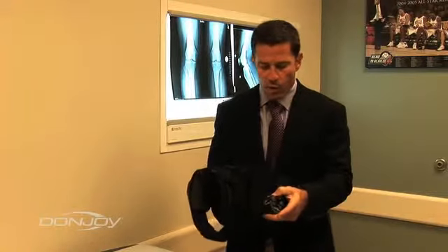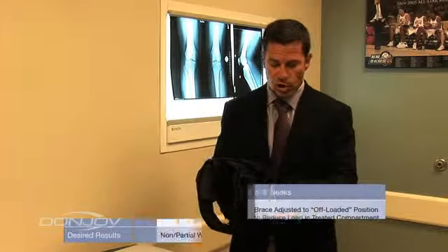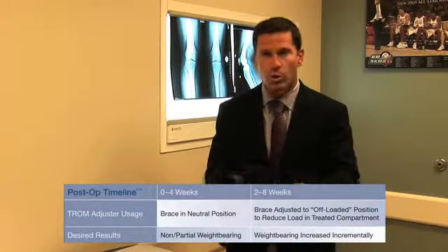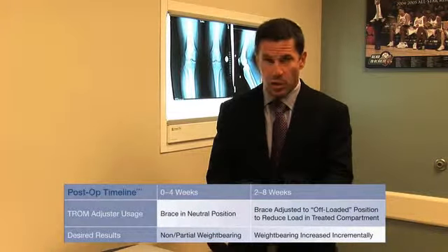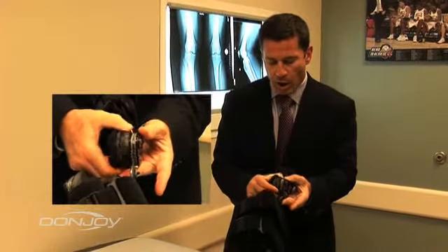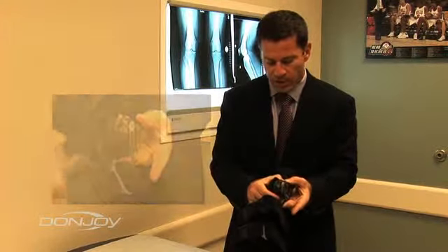Then at the 3 to 4 week mark, again depending on the surgical procedure, I want to start letting that patient progressively load the compartment to start to accrue the biologic benefits of that. How do I do it? I actually will start dialing in a degree of unloading or offloading, if you will, of the involved compartment.